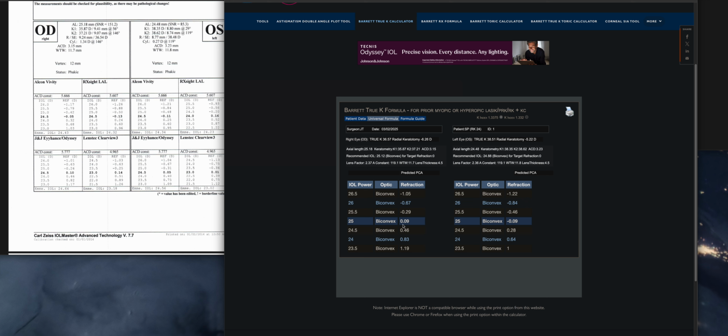So what's their true refraction after maybe 2 months of letting that swelling decrease? That hyperopia will go away. It's probably going to be pretty close to this, but I have seen cases where you don't shake it. There's still going to be a residual hyperopia there. So we're not going to be alarmed if our patient comes out +1, +1.5. There's 24 RK cuts, and that's okay.